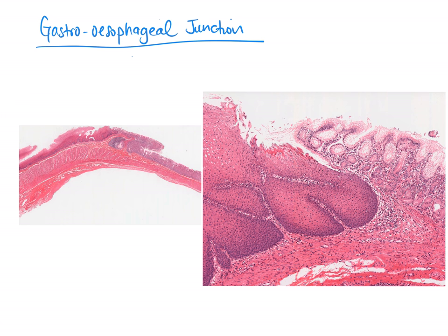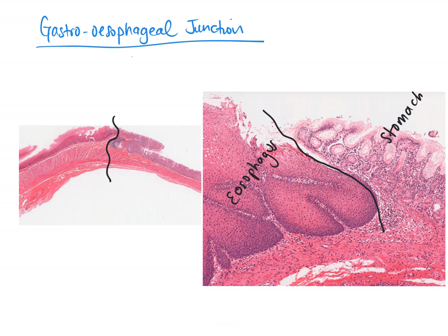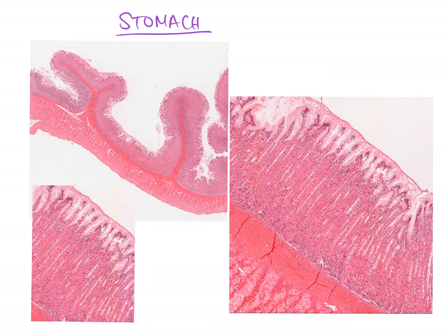This slide shows the gastroesophageal junction — the junction between the esophagus and the stomach. On one side is the esophagus, identifiable by its stratified squamous epithelium; on the other side is the stomach. This junction is really distinctive and sudden — there is no gradual transition. When you hit the stomach, it doesn't have stratified squamous epithelium; it has simple columnar epithelium.